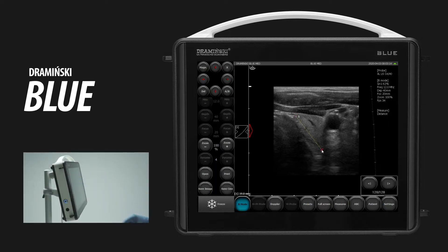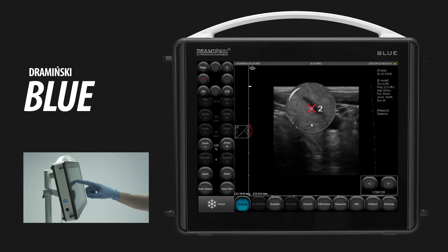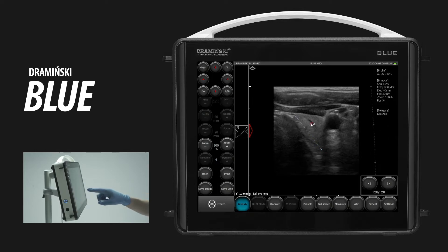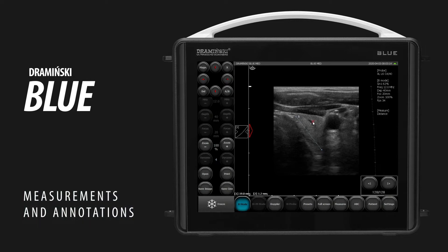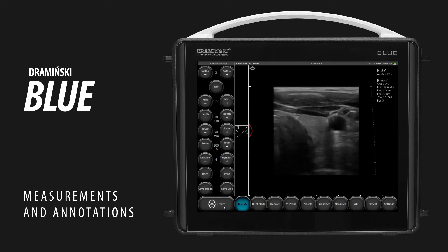To use the magnifying glass, press and hold to set the first measuring point. Remove the finger from the screen, then press and hold to turn on the magnifying glass again and move the second measuring point to the required location. Results are displayed in the left bottom corner of the screen.